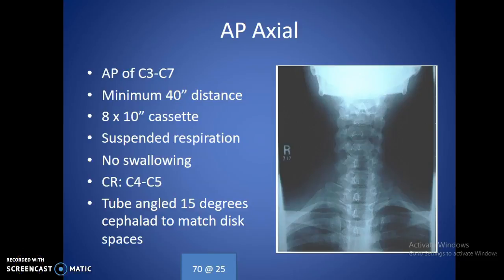Alright, so this is going to be part 2 of the C-spine. It didn't quite fit all the way on that one 15-minute section, so we have another section for this, which hopefully shouldn't be as long.